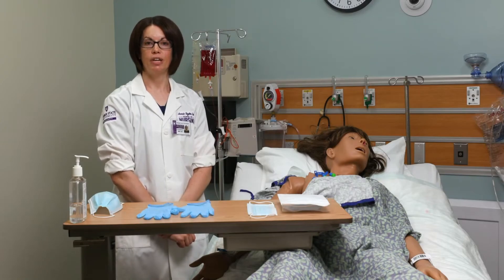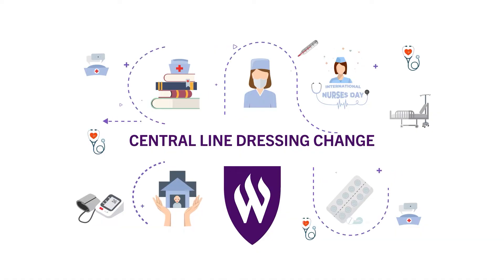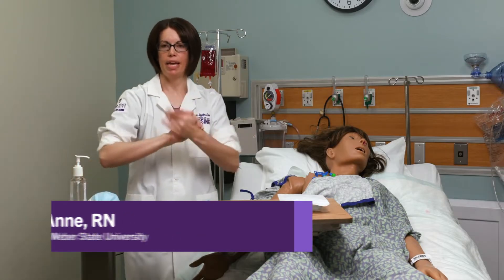I'm going to be demonstrating a central line dressing change. First I'm going to come into the room and I'm going to wash my hands or sanitize my hands.